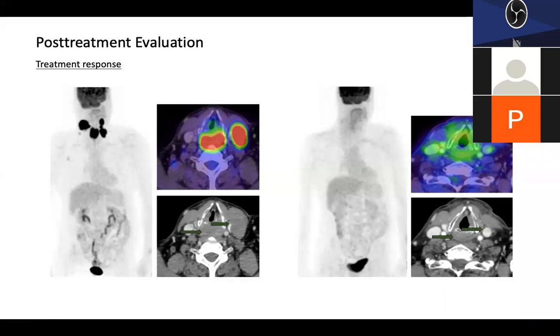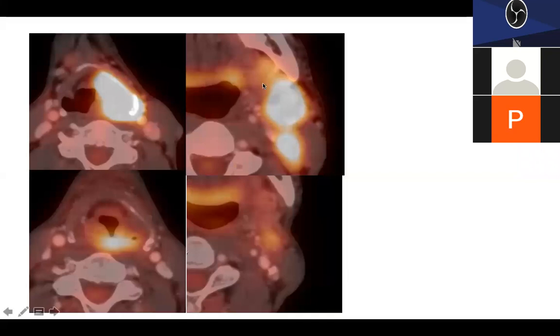So I might give it a NIRADS 2 just because there is some local... for all practical purposes, that's one. NIRADS is a response assessment system that we are doing. So here, we had discussed what will be the NIRADS score for this patient.